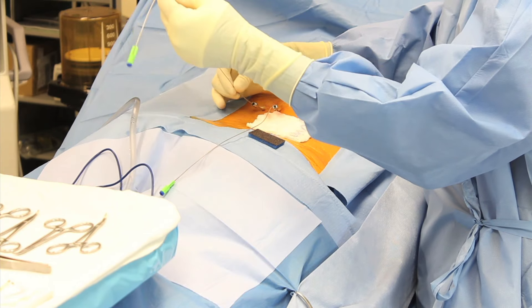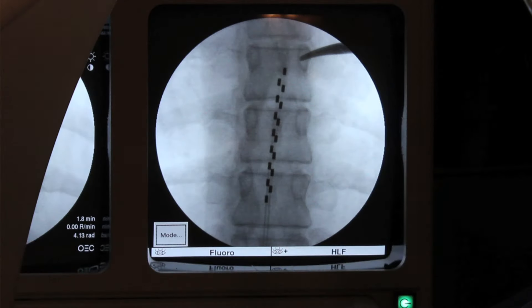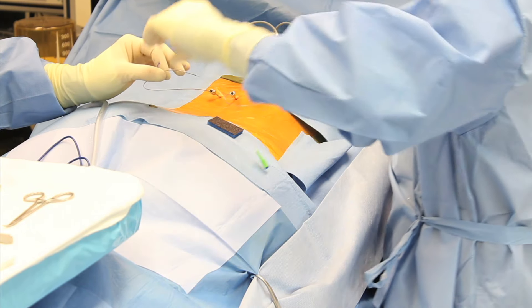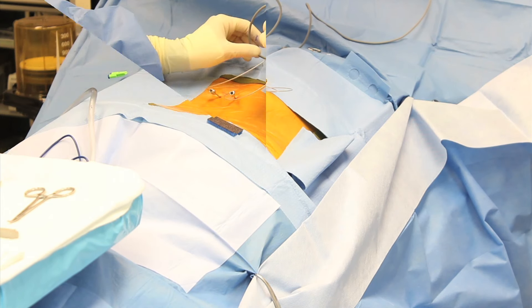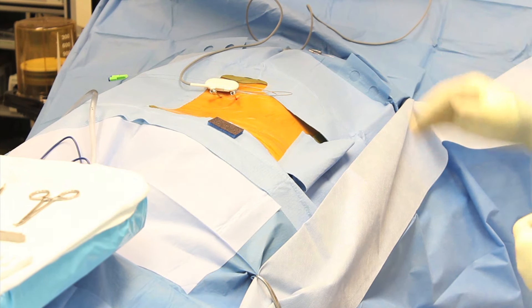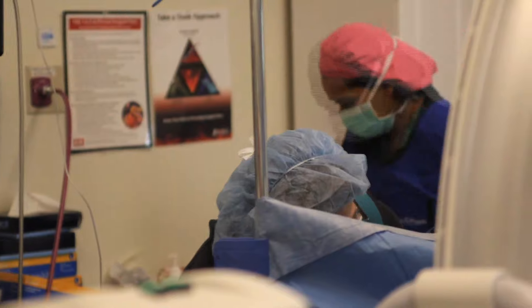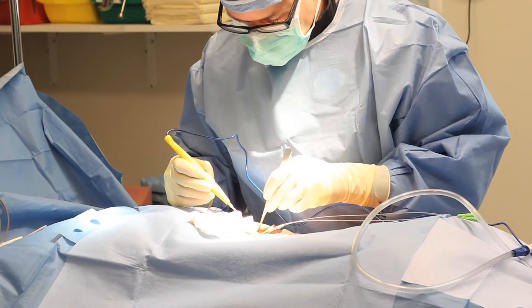Once the electrode wires are placed in an appropriate position, the device is connected to a cable, and in a sterile fashion with the patient awake and talking, the device is analyzed to make sure that the patient has a comfortable, appropriate sensation in the area of previous chronic pain.